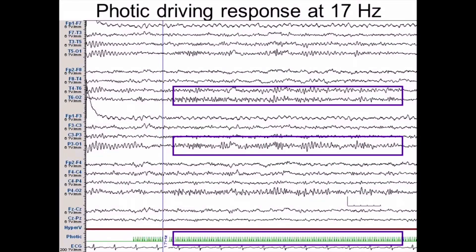Now I noticed something very peculiar when I was running the EEG. While doing an EEG you do these things called activation procedures, and one of them is called photic stimulation. All that is is you shine a bright light into the patient's eyes — normally they can have their eyes closed — and you're going to want to see something called photic driving. Photic driving is when, every time there's a light flash, there will be a corresponding wave on the EEG right in line with that flash. You'll see that on both sides of the head — O1 and O2, which process visual information — waves in line with each flash of the light.